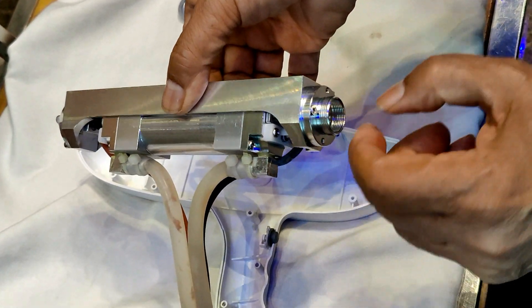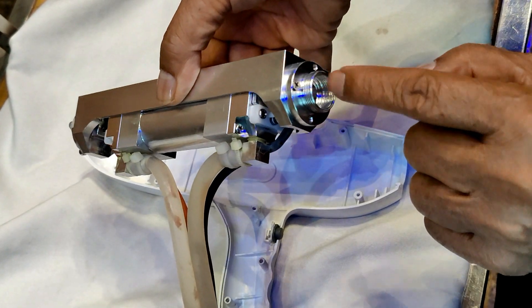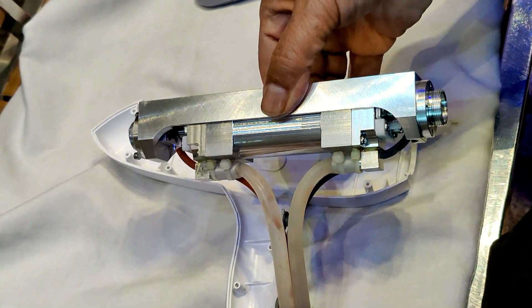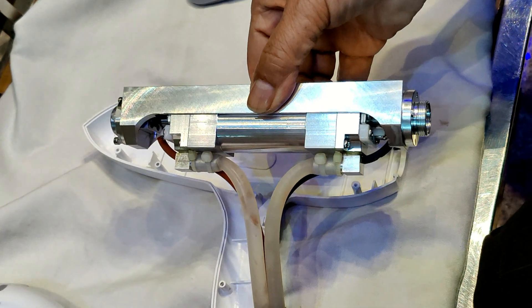There is partial blockage of the water flow inside the water tubes. Otherwise every connection of this tube is normal. We have cleaned the water from inside here.